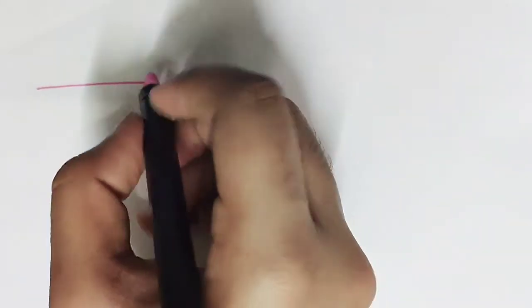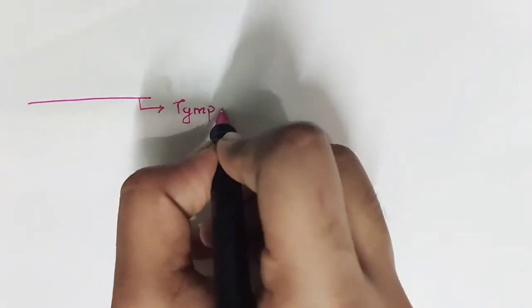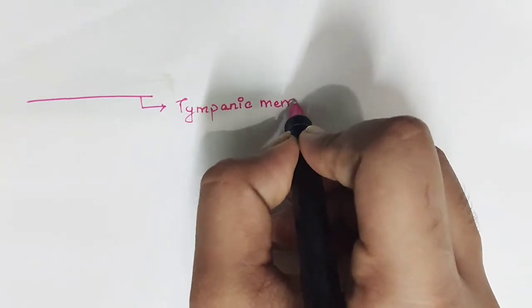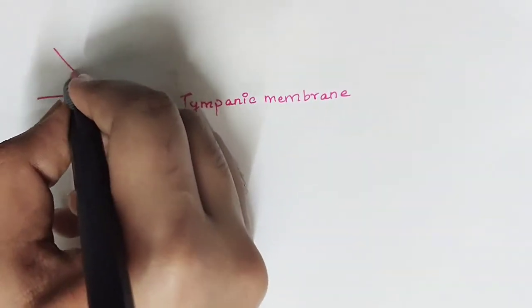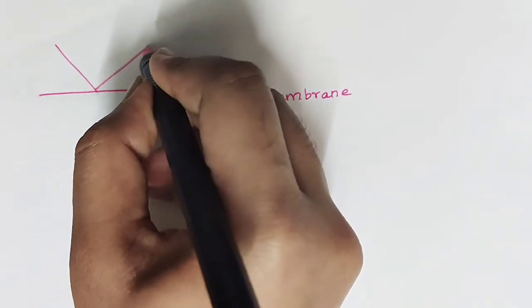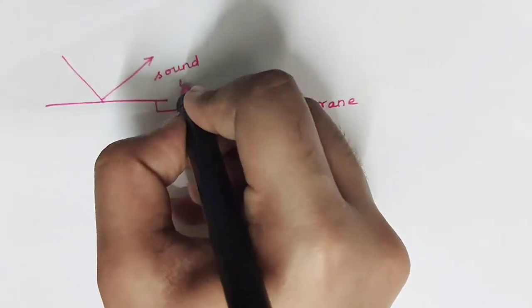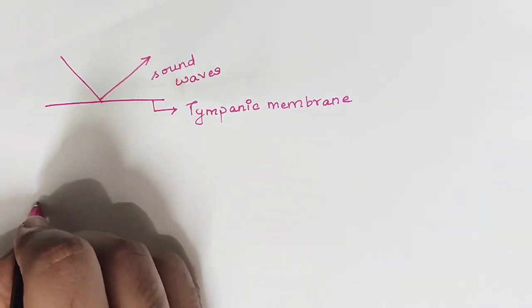After understanding the basic physics, it is clear that the tension or resistance in the tympanic membrane is responsible for the reflection of sound waves which we give with the probe from the external auditory canal in tympanometry. Thus, if the resistance of the tympanic membrane is more, that is, if the tympanic membrane is more tense, more sound waves will be reflected.